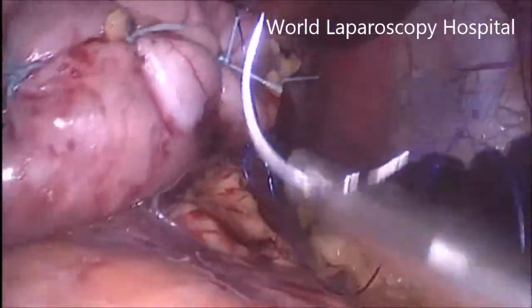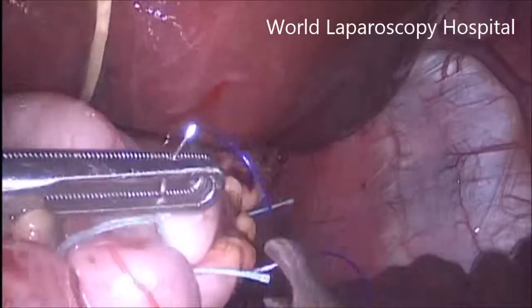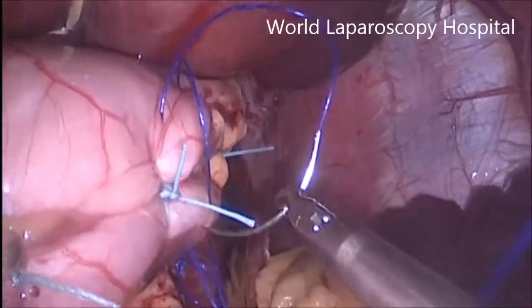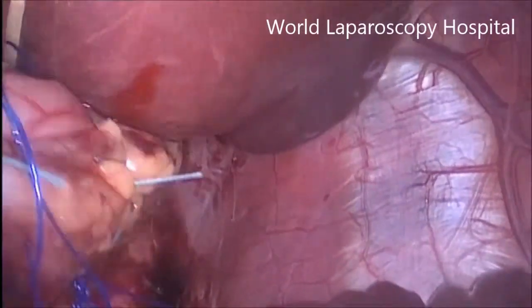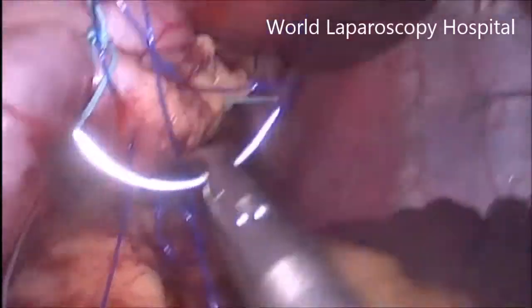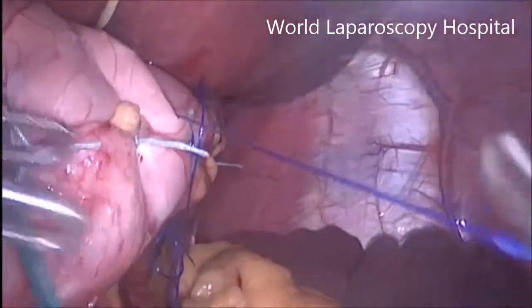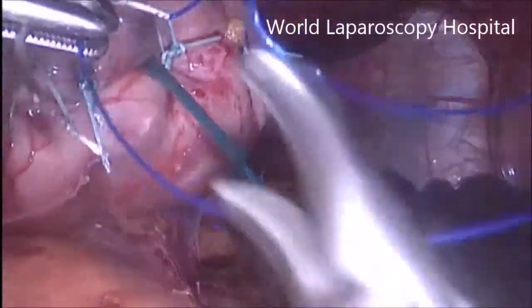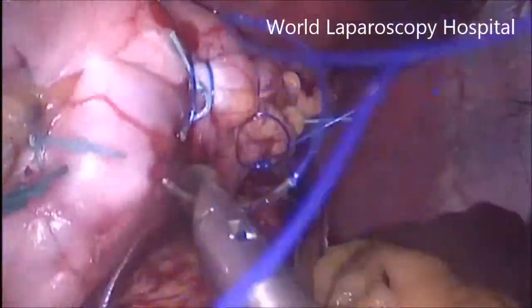Now this is Proline. You can start with a Dundee jamming knot from near the fundus. And this is the third row of suturing, which you can start with the polypropylene. That will give you a better effect. This is a continuous suturing which you can do. An advantage is it will reinforce any weakness of the first and second suture line.